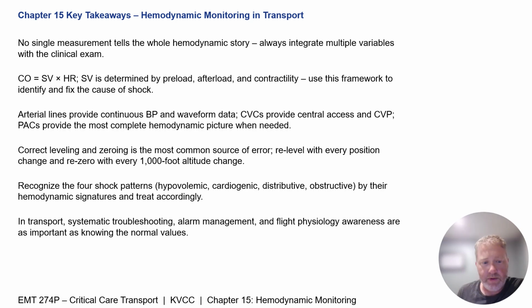And then finally in transport, your systematic troubleshooting, alarm management, and keeping in mind the flight physiology. Those are all important, and more important than just memorizing the normal values of some of those things.